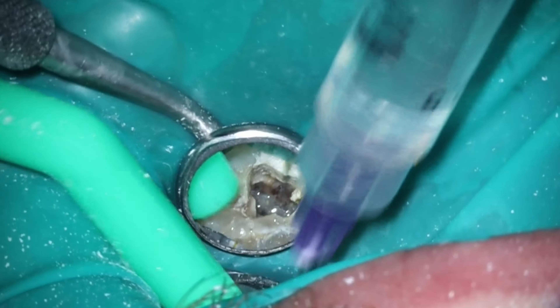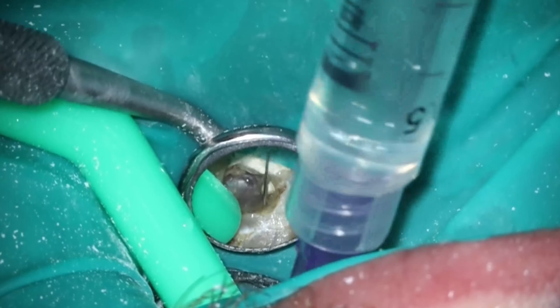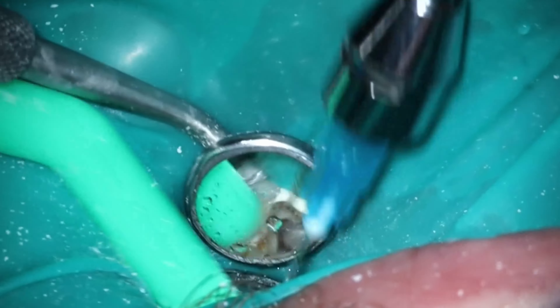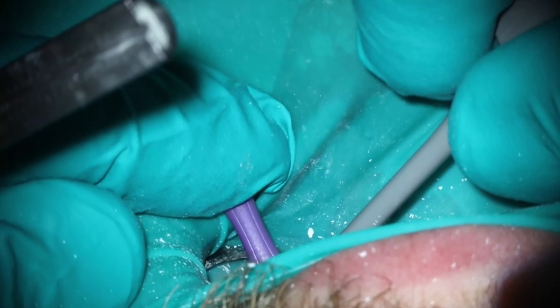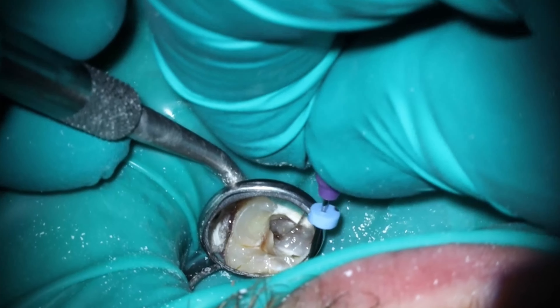As far as the other things that they did, I do like that they did such a nice temporary restoration on top. I'm leaving that IRM — it's not my favorite material because it's messy. However, with a vital case, IRM and that eugenol does have the tendency to really calm things down nicely. You can see I'm still removing Vitapex, and even in the final photo you'll still see some yellow because you can never get that all out. I do like the temporary they used. Cavit would be my preference, but if you're going to do a temporary on a vital case, I would recommend IRM over Cavit. Cavit will desiccate the tooth and can cause quite severe pain and sensitivity if you put it directly on top of a vital pulp. So IRM probably was the better option here because they didn't do a full pulpectomy, just a pulpotomy.